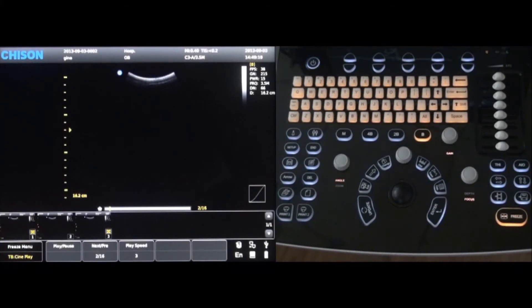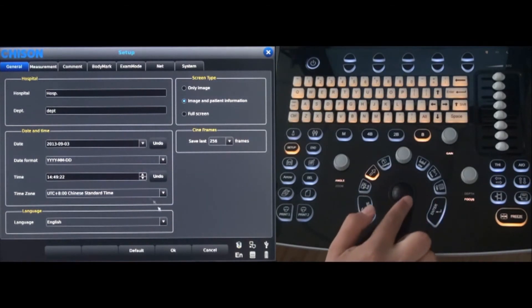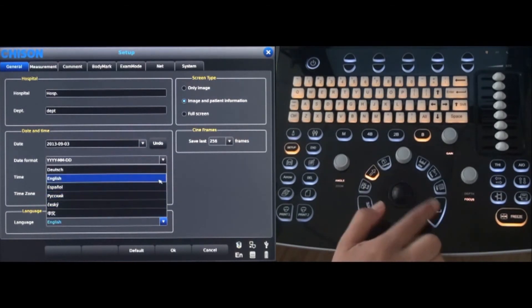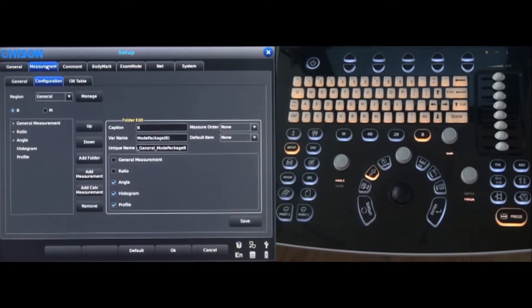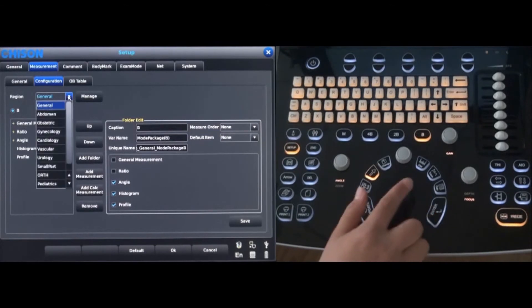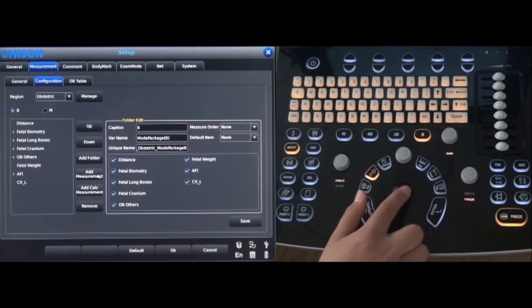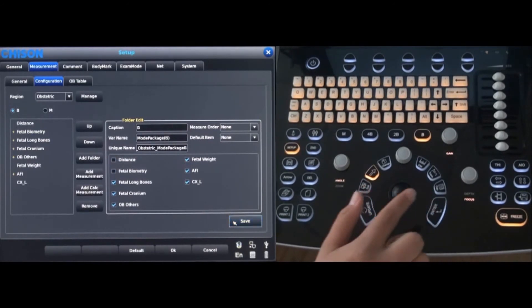System settings can be customized by pressing the setup key on the keyboard. In the general settings tab, information can be changed for the hospital, date and time, and language. Select the measurement tab and the configuration can be customized. The drop-down menu shows the different applications that can be changed — for example, choose OB and the settings can be changed and saved.